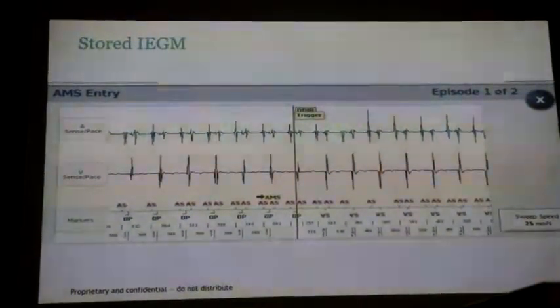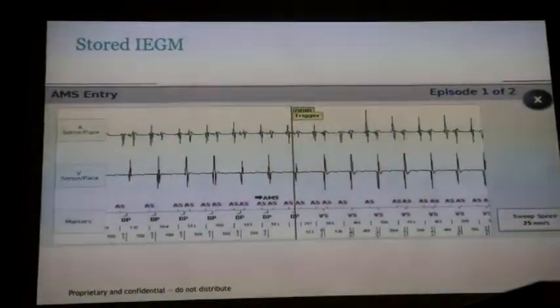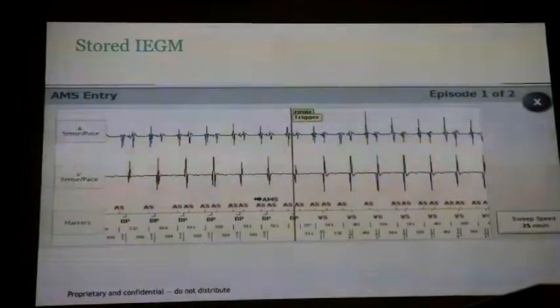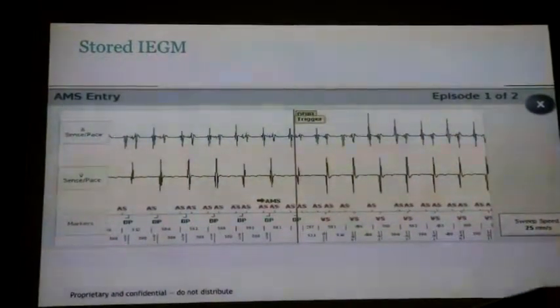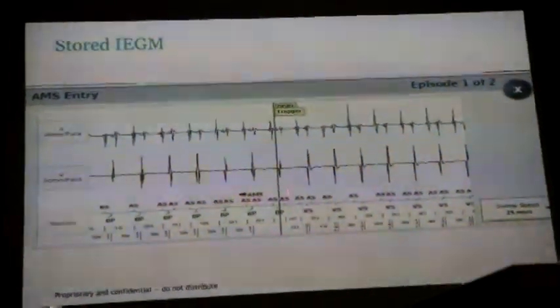So in the pacemaker it is AR, and in the ICDs it is A sense. And if it's in blanking, it's 0. In the pacemakers, they're only feeding one counter, the AMS counter. Here they're feeding both counters. And this is the problem, right?